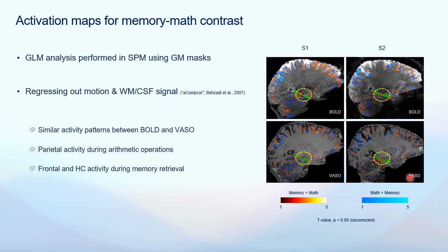As depicted here in two representative subjects, the activation patterns for BOLD and VASO images were quite similar.